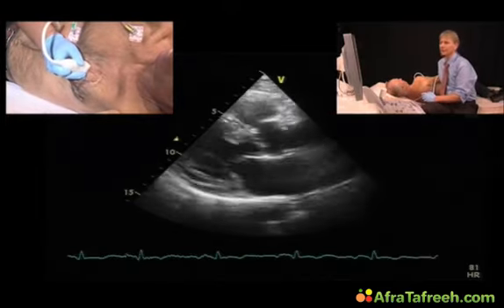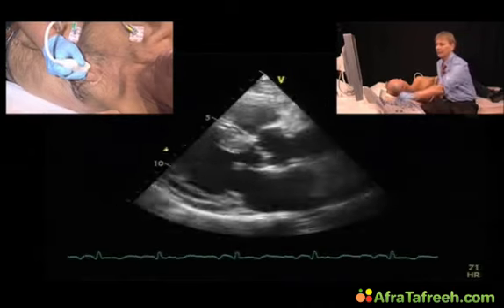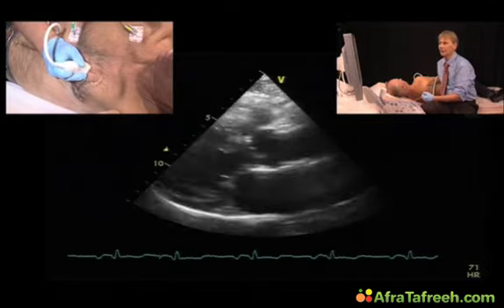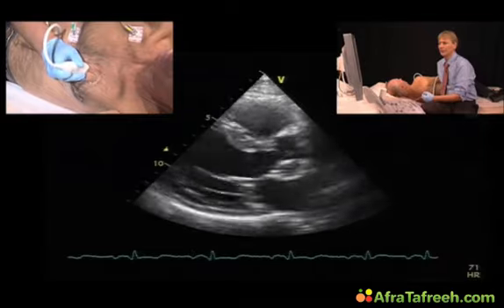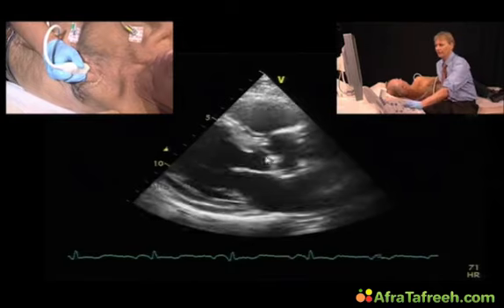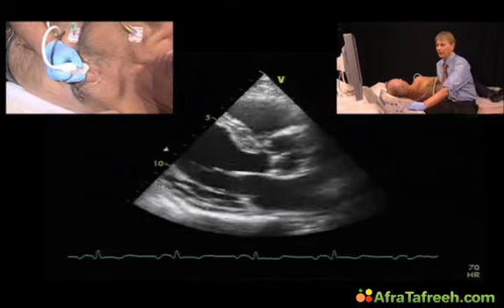This is the parasternal long axis view, and what we appreciate is that the patient must also have other risk factors, hypertension, simply because there's left ventricular hypertrophy. There's also aortic valve sclerosis, and we also see degenerative changes of the mitral valve apparatus. But what we also see immediately is that there's a scar here in the posterior wall.